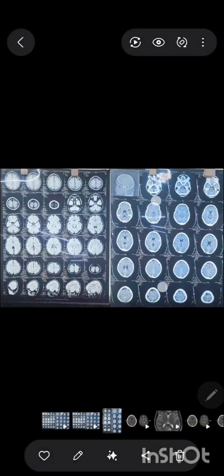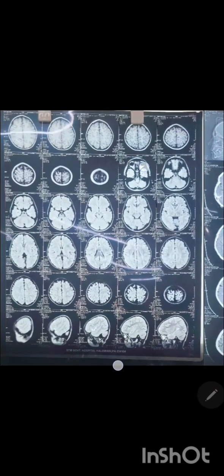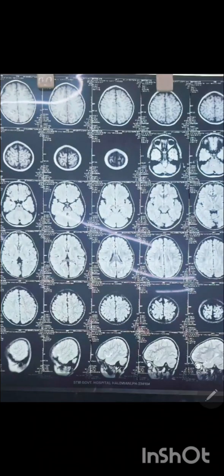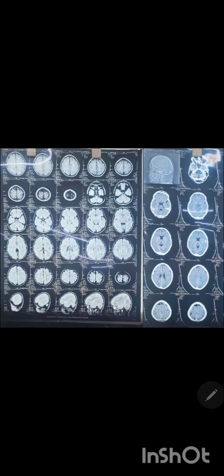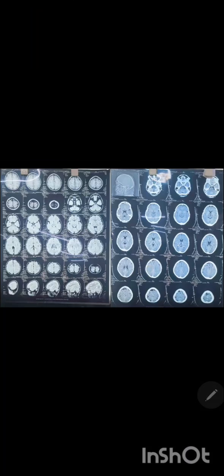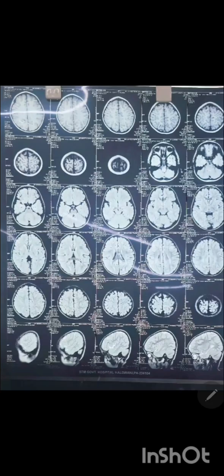And if low density tissue is present, such as brain tissue or other viscera of your body, like the lung, it absorbs the radiation to a lesser degree and there is a greater signal detected by the scanner. So this is the performance difference between the CT and MRI on the basis of high density tissue and low density tissue.